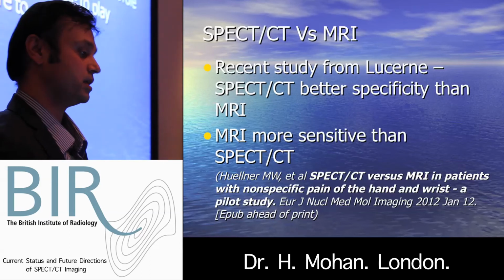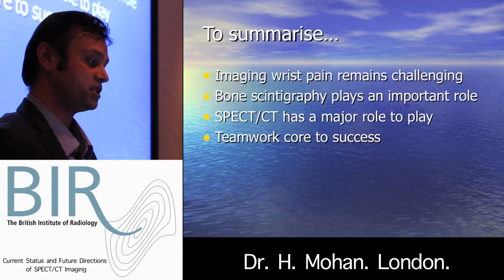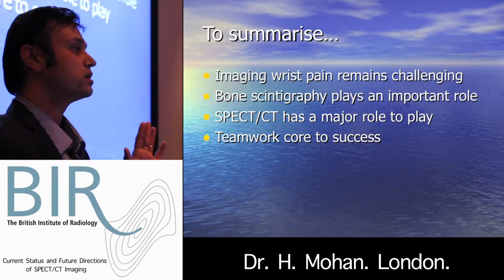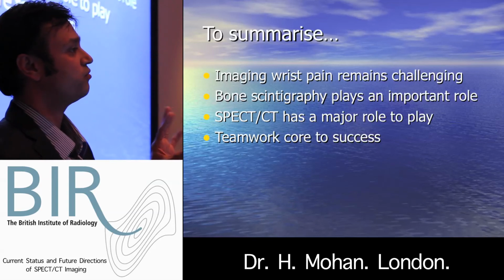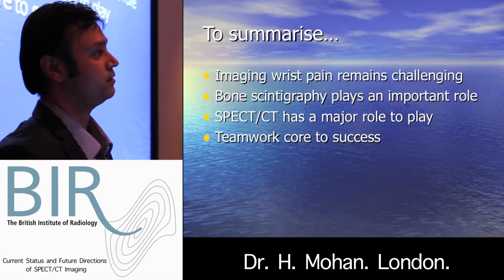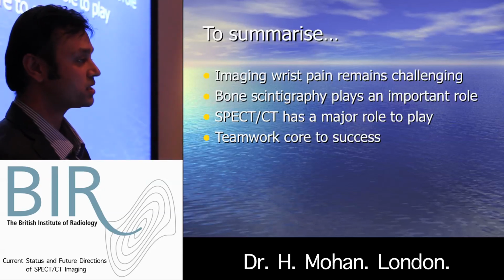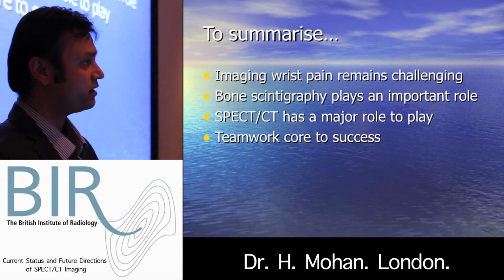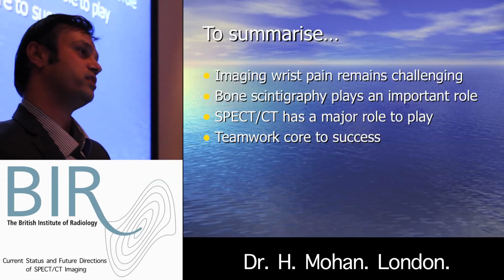So to summarize, imaging reasons for wrist pain remains a challenge, of course. SPECT CT, as I described in the algorithm, where bone scintigraphy had been at the center of trying to direct the physician into which direction to go, I think, would have a very central role in diagnosis and management of these patients.